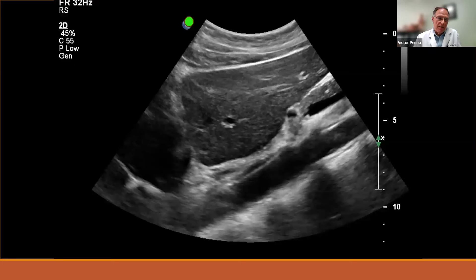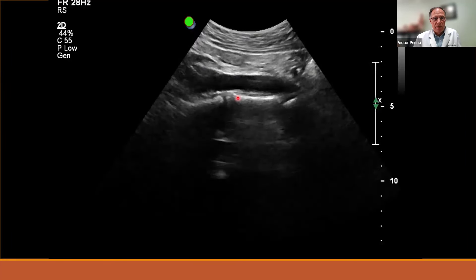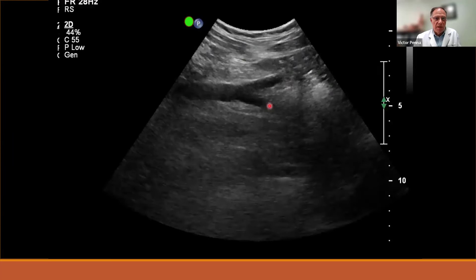Continuing on the sagittal plane, we can see the aorta running underneath toward the heart, with either the celiac trunk or SMA coming out. Vertebral bodies appear posteriorly. Moving further down, we see the cartilage disc and the aortic bifurcation. The bifurcation with the common iliacs on both sides is more of a coronal cut than a true sagittal cut.